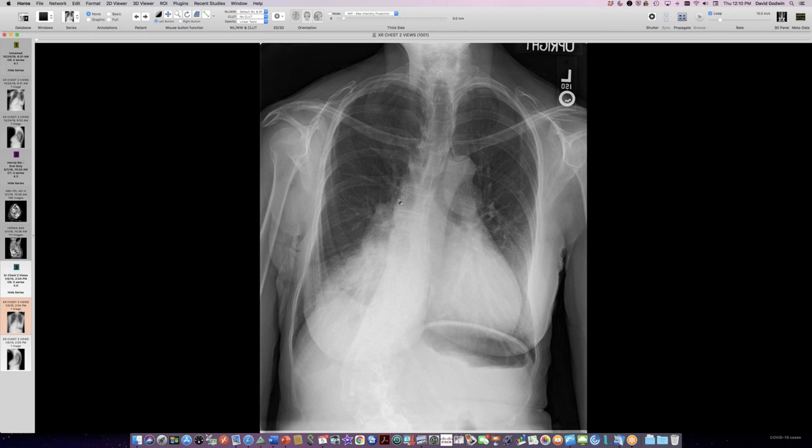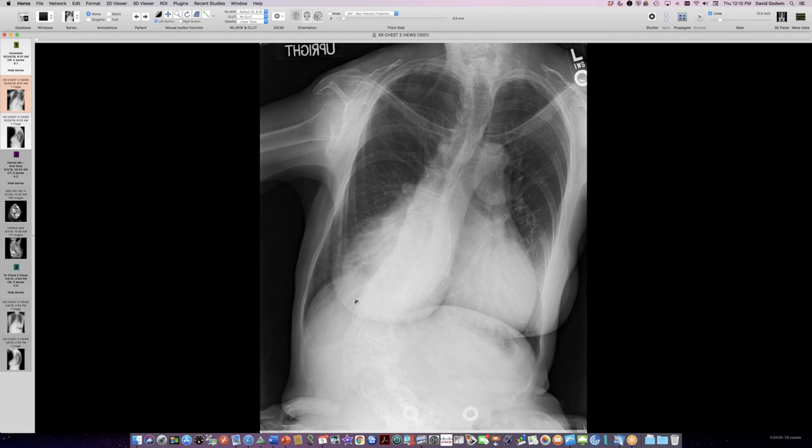Yeah. And then this person has what looks like a horrible pneumonia in this right lung base. And this is 2015. The amazing thing is that this pneumonia is still there a few years later. This is now 2019. So persisting pneumonia over such a long period of time.